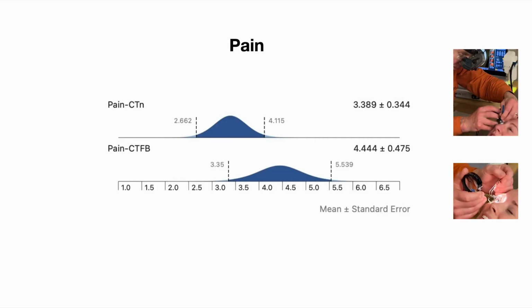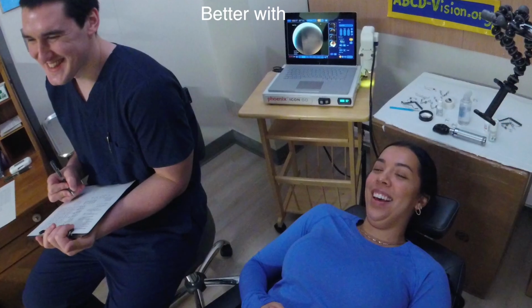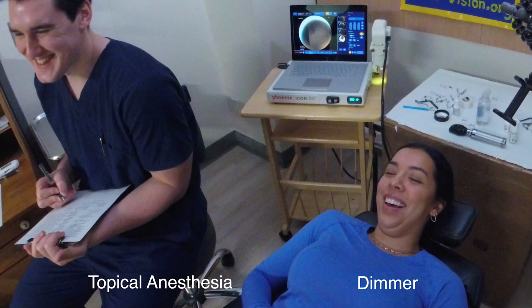Measuring pain and the influence of bright light on pain using the same scleral depressor, the increased brightness of the indirect exam resulted in a small but not significant increase in pain. Concerned adults preferred topical anesthesia and decreased brightness for exams.